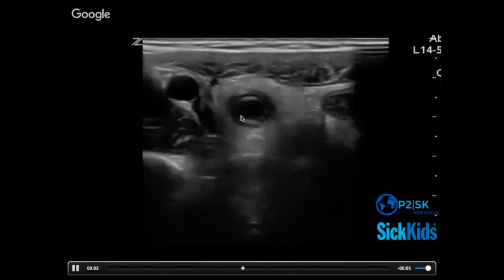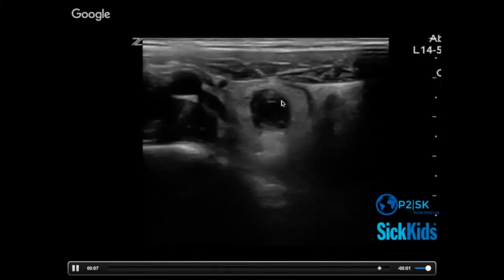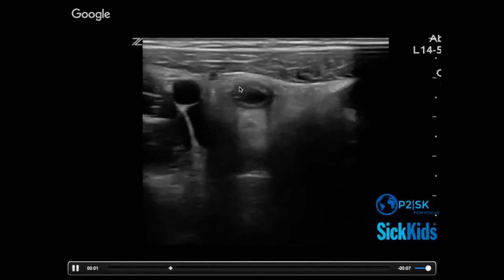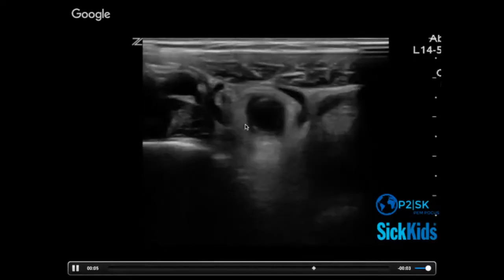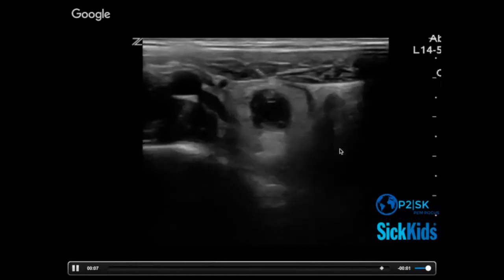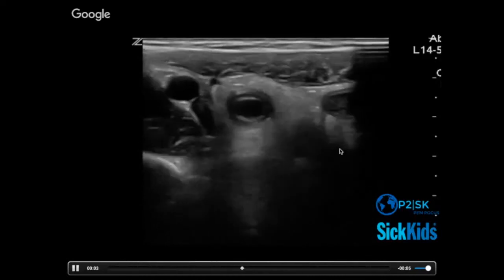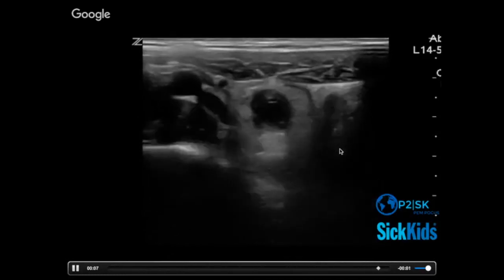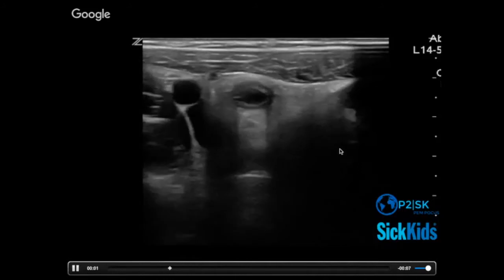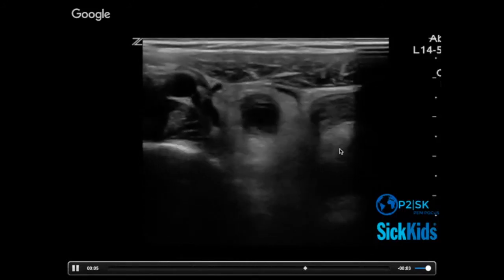If you were to try to look at this submucosal, the bright halo within, it's nice and bright at the start, but then there's areas where you lose it, and it kind of fades out, and that's one of those secondary signs that it even fits more in the perforation direction? Do you think you'd also get that just from not being at the right angle? Yeah, absolutely. I feel like it's just a perpendicularity.